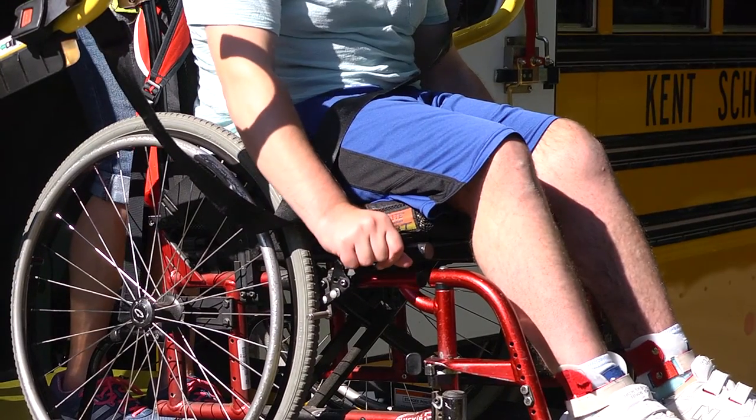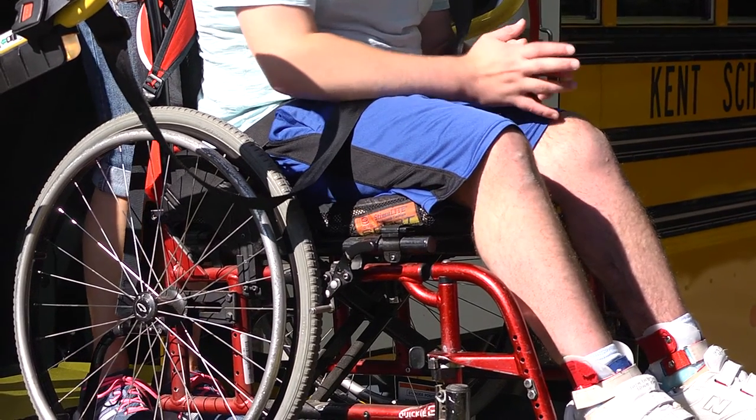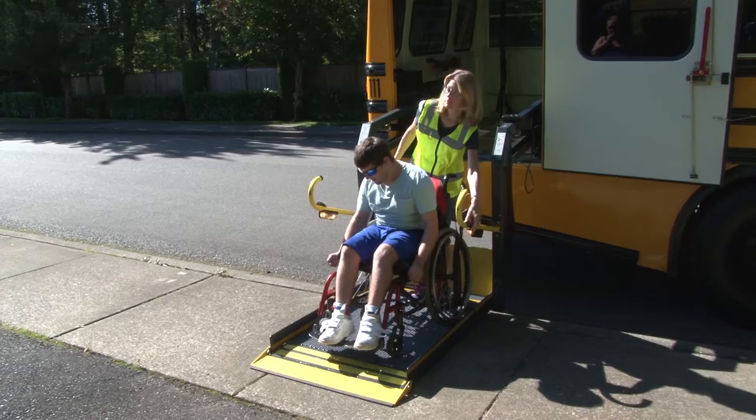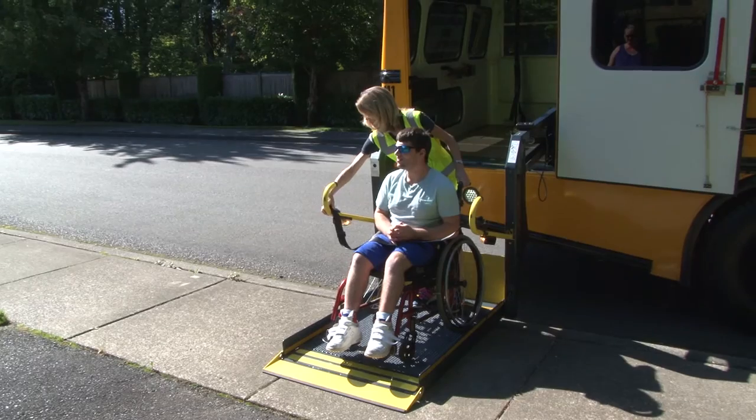On a manual chair, be sure to set the brake and make certain the chair is in an upright position. The chair should only be reclined if medically necessary. Secure the ramp safety belt, making sure the ramp flap is up.